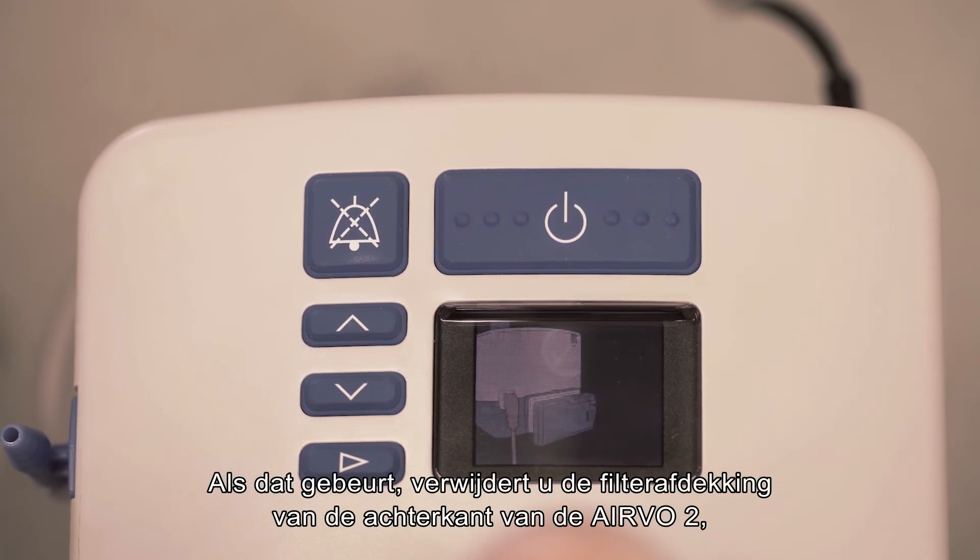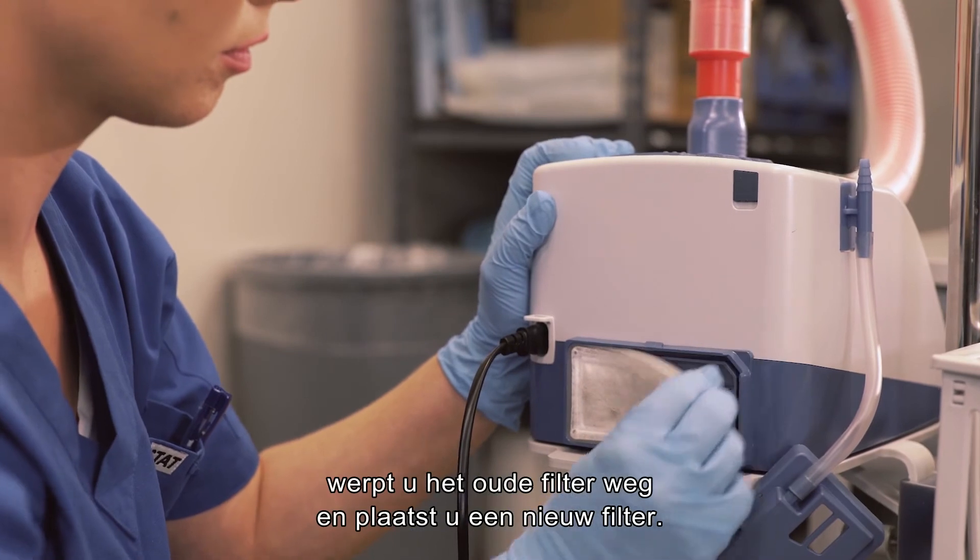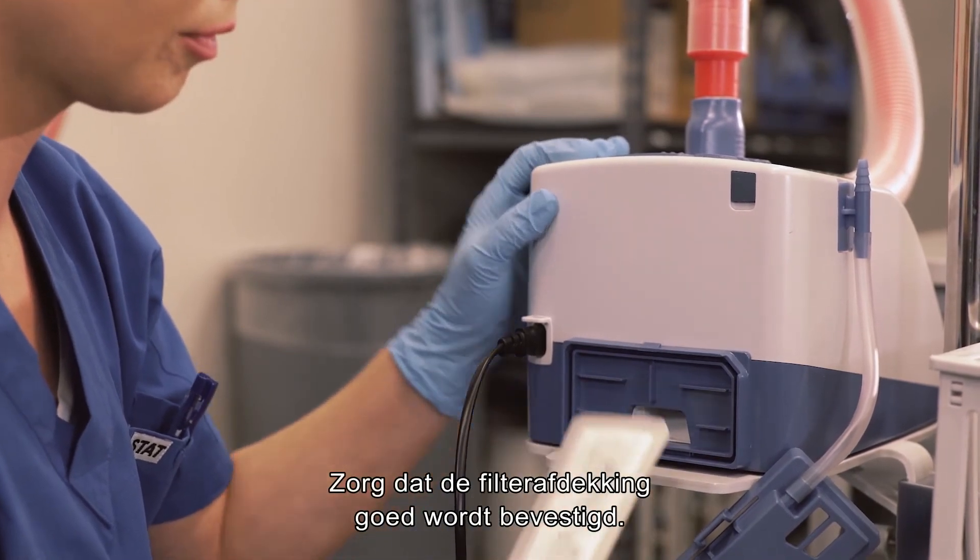If so, remove the filter cover from the back of the AIRVO 2, discard the old filter and insert a new one. Make sure the filter cover is properly attached.